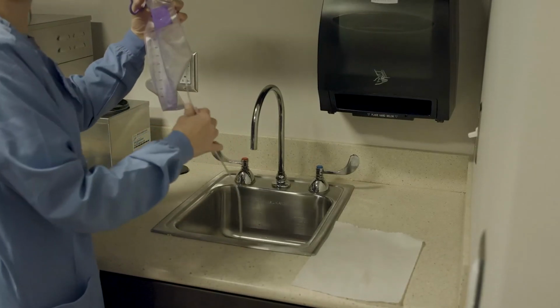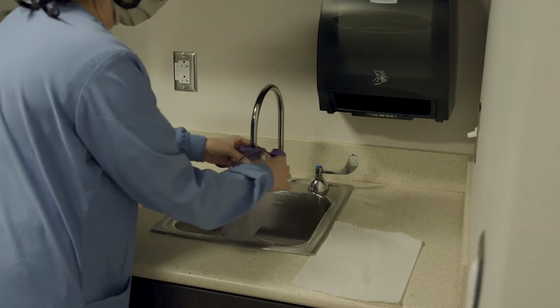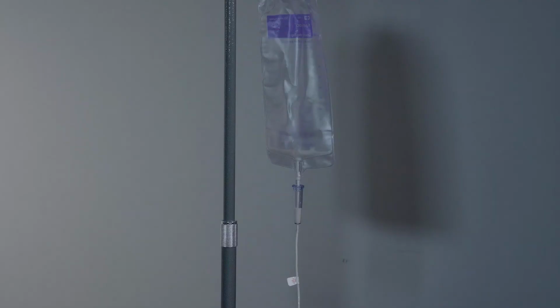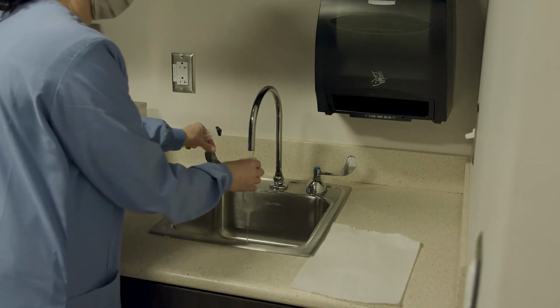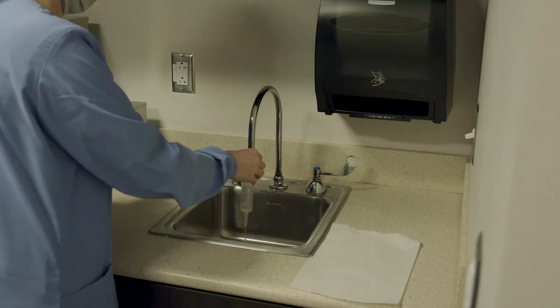Rinse your feeding bag with warm tap water and allow to air dry by hanging with the top open. Feeding bags with tubing should be replaced daily, and syringes should be replaced weekly. After use, they can be disposed of in your household garbage. Wash your syringe with warm water and dry. The syringe can be stored in the original packaging until its next use.